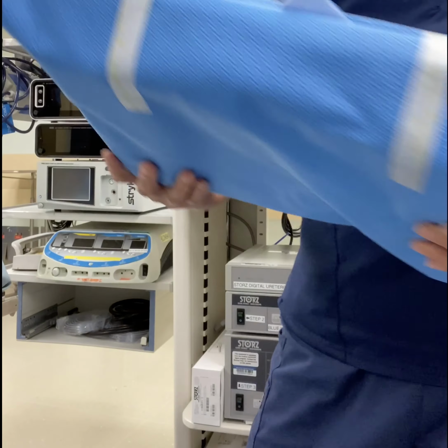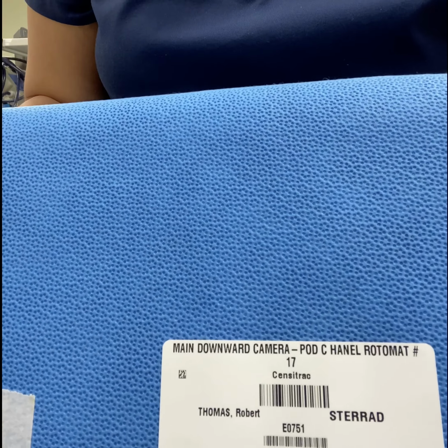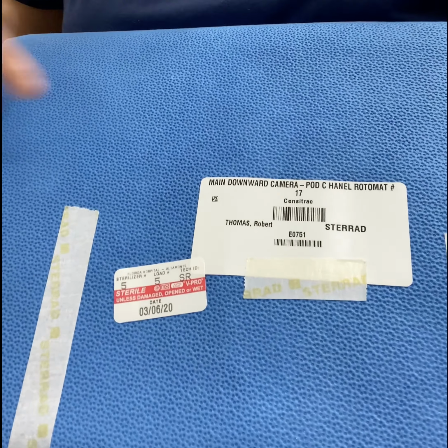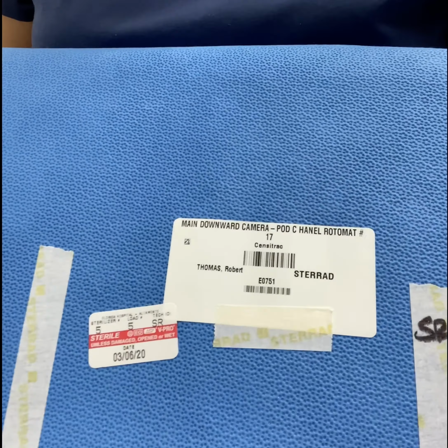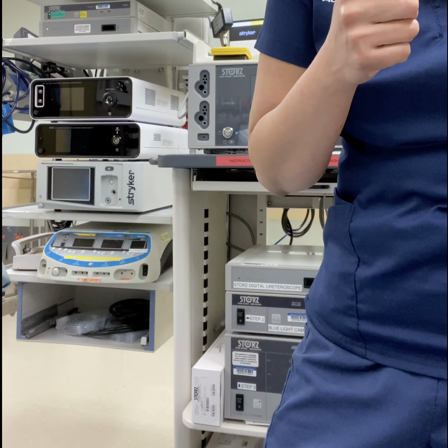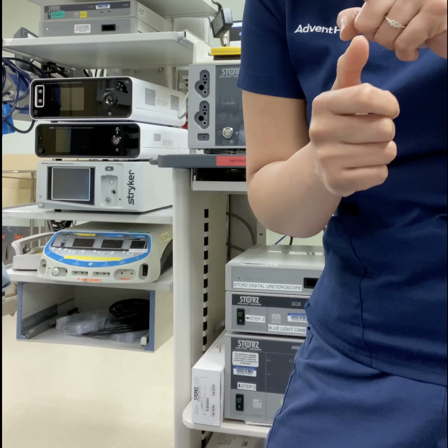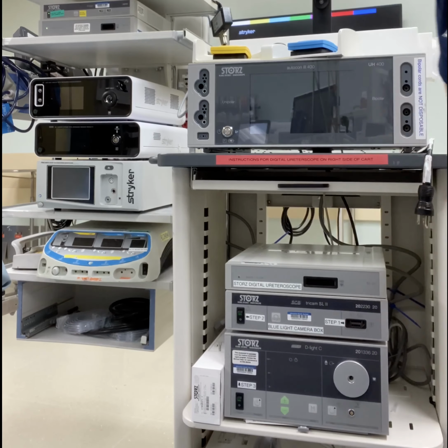And of course, if you're already doing a cysto, you'll have a downward Storz camera. If you do not have one in the beginning, because you guys were using Stryker, that's okay. Go ahead and open the downward camera setup, because the Storz downward camera head is the camera head that allows you to switch from a regular cysto view to the digital ureteroscope view. Okay, so those are the three main players for this.